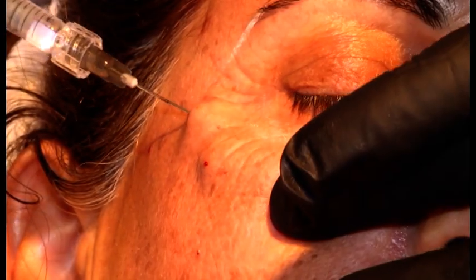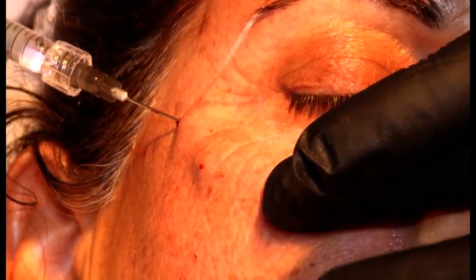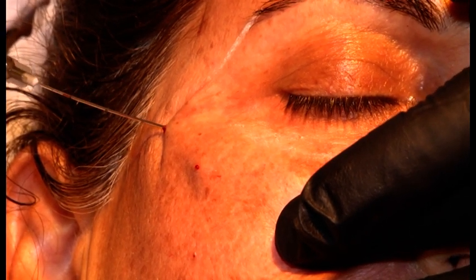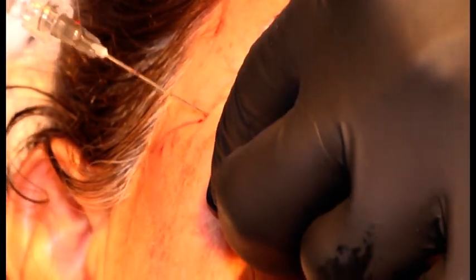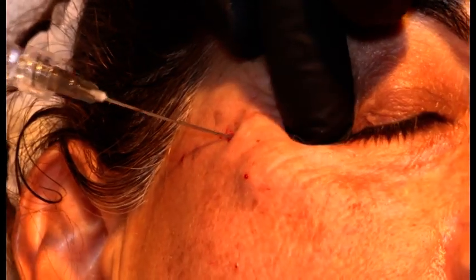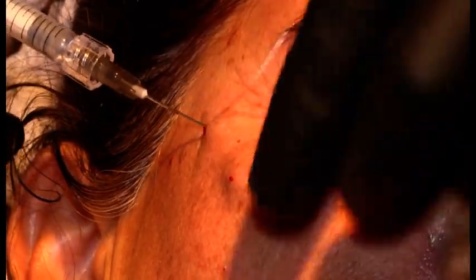Check tip location. It's over here. Start to inject. About 0.1. And then again, rock and roll.